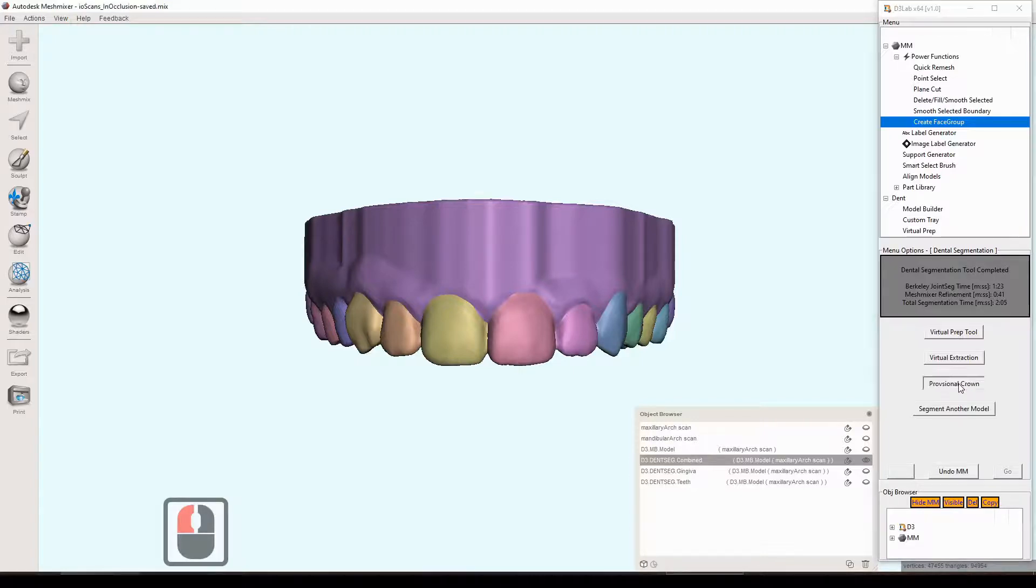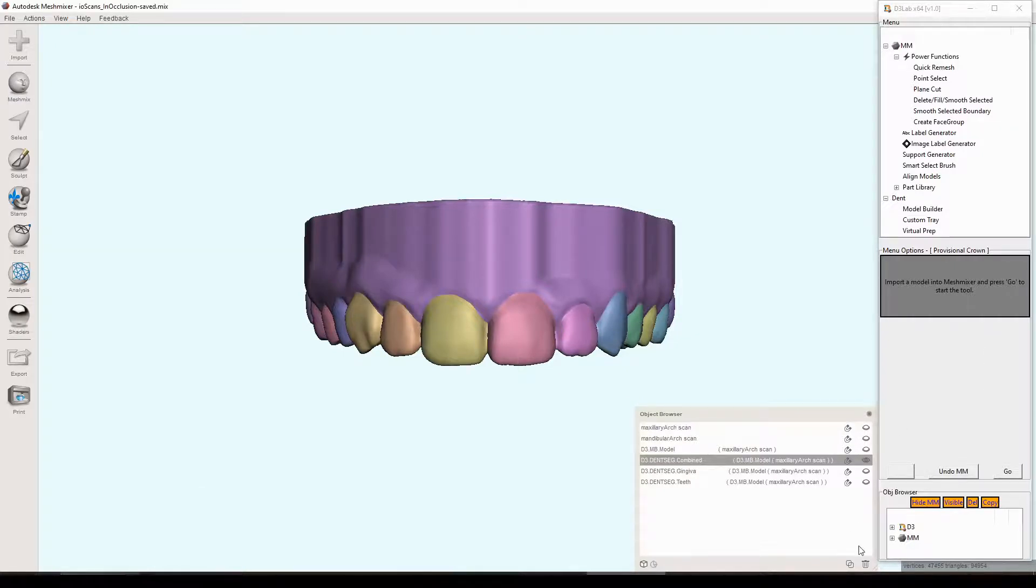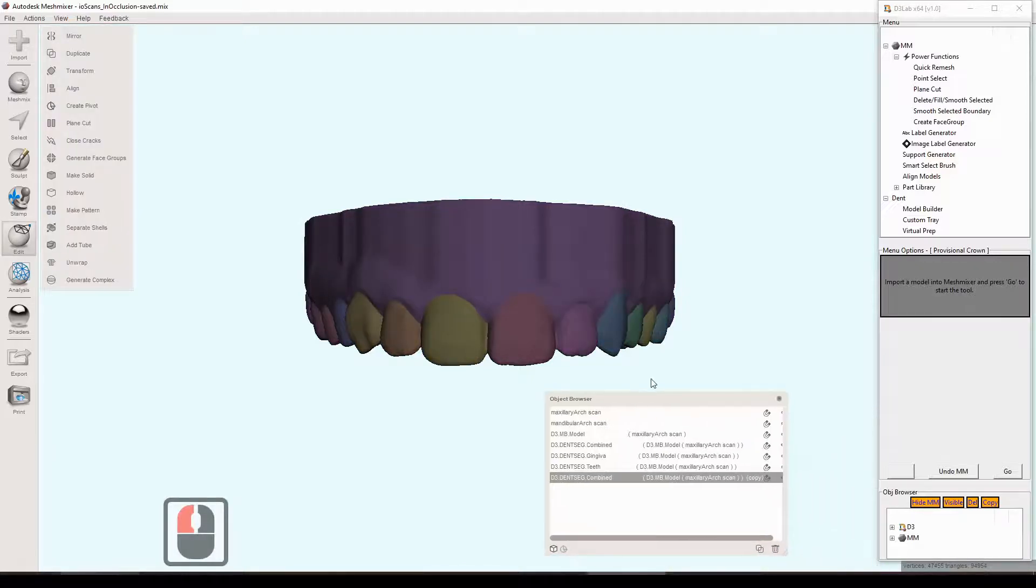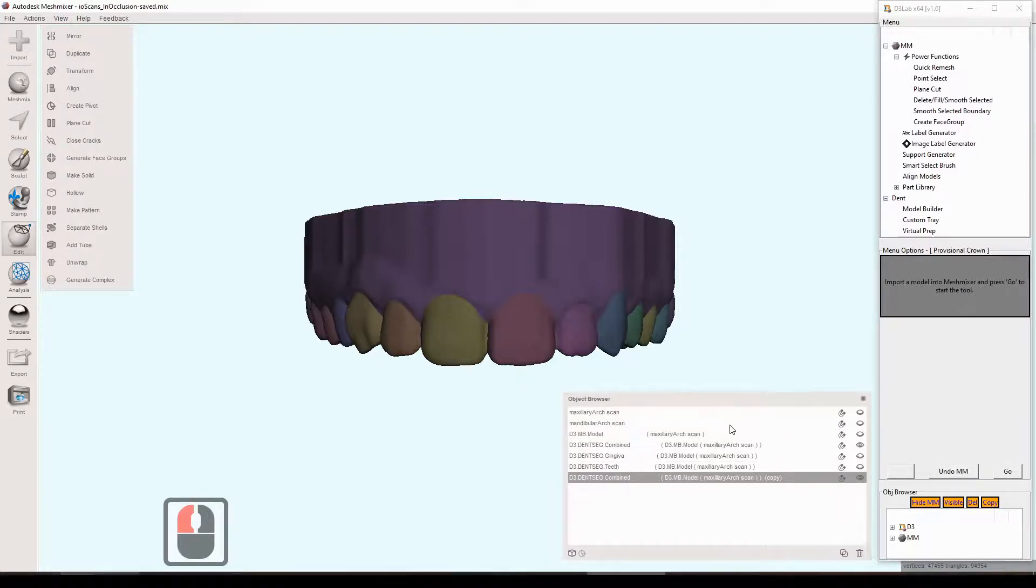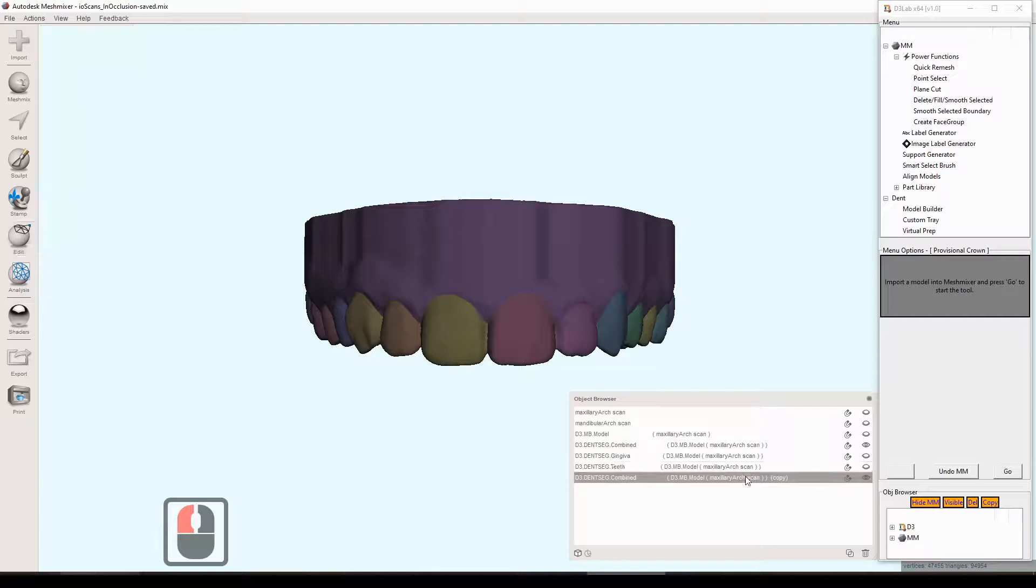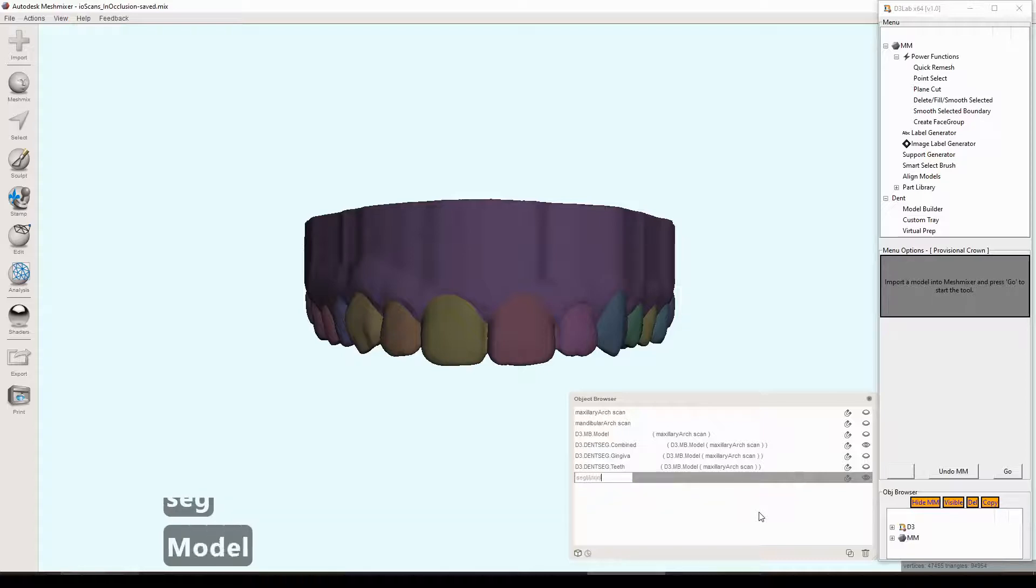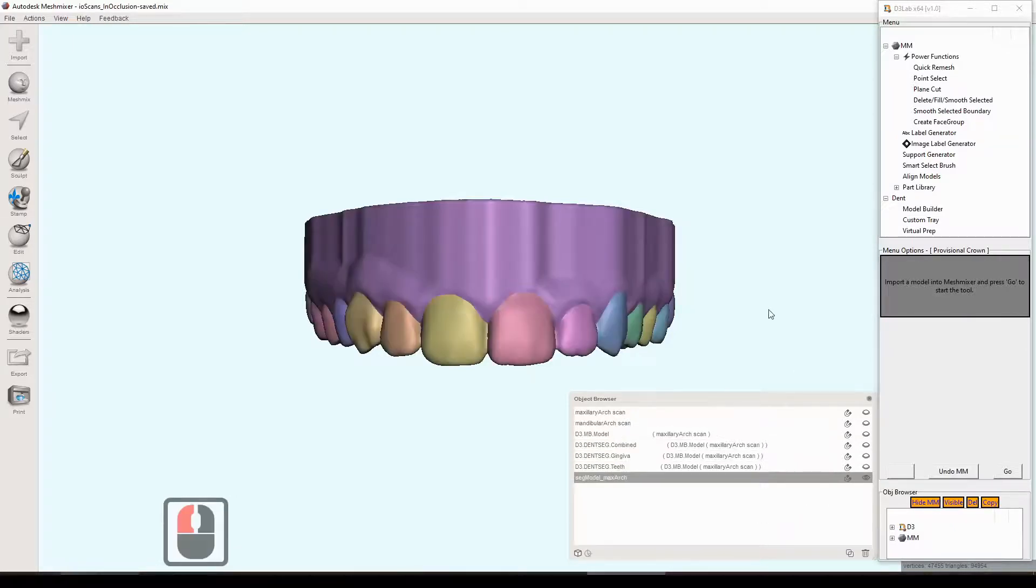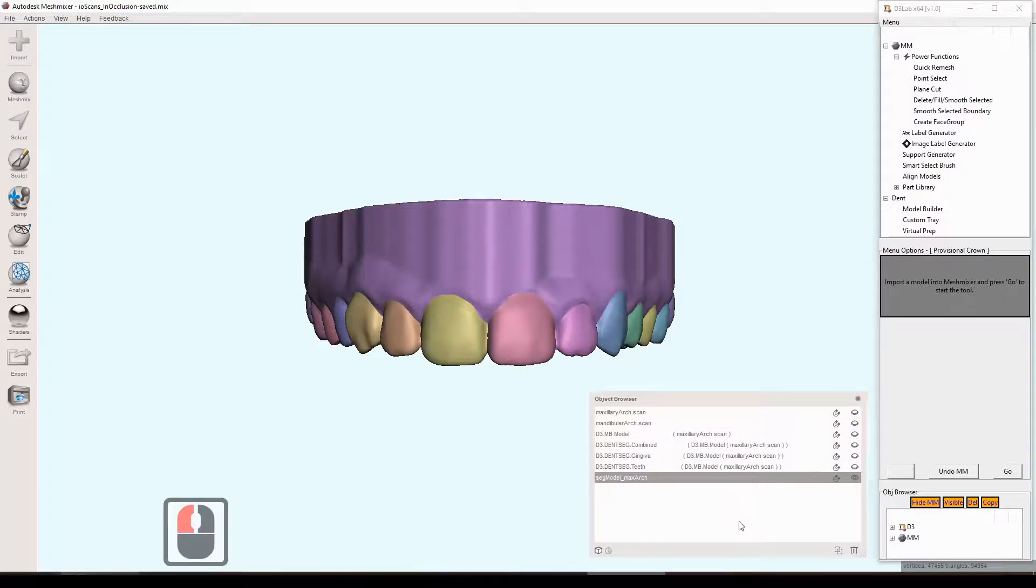So that's what our input is going to be for these tools here. We'll start with the provisional crown tool. It says import a model that you'd like to use the tool with and then press go. I guess before we do that though, probably a good idea just to make a quick copy of this model, rename it to something shorter. Just so when these tools are done, the object name in the object browser isn't ridiculously long. Just making a quick copy, changing the name, make it a little bit shorter and then I think we are ready to press go here.